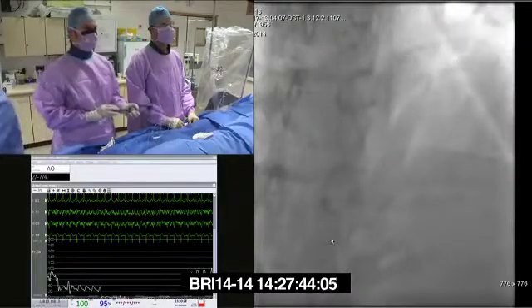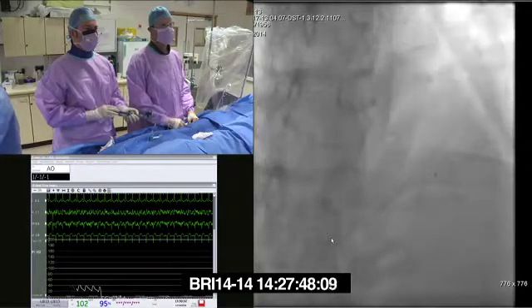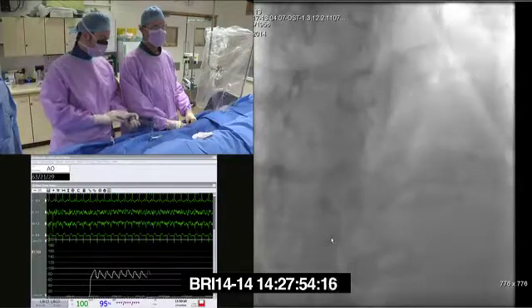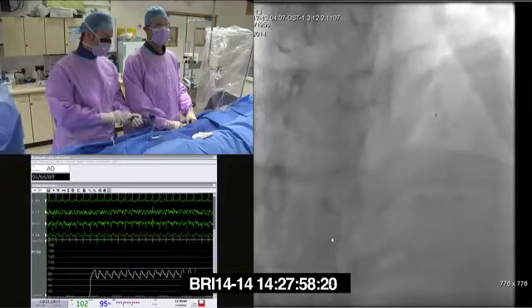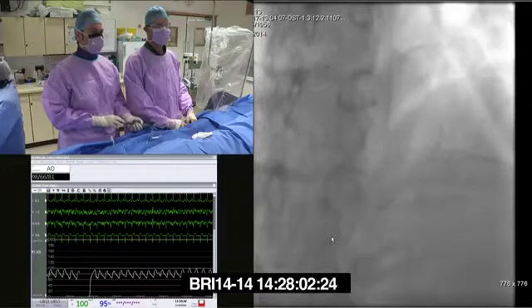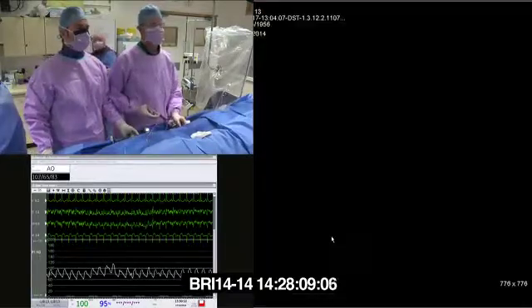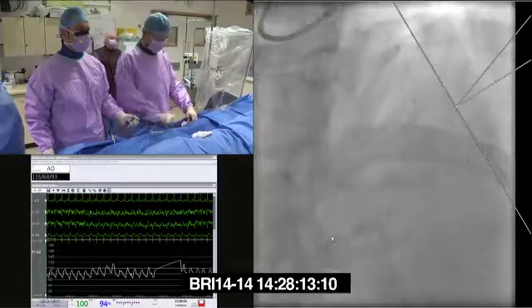There is clot? Yeah, okay. So just find out where we are. Just go up there. 10, 12. That's great, and down. Down from 12. Once that can go through, just center over a little. Okay, so big territory affected.